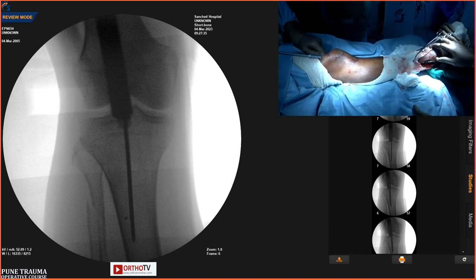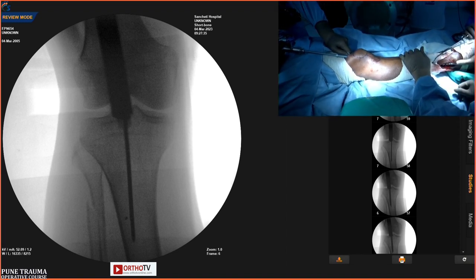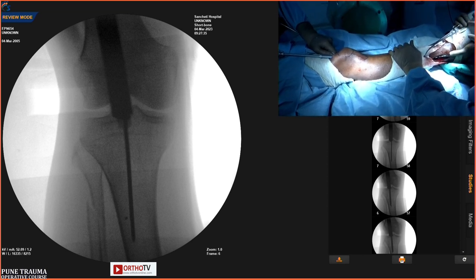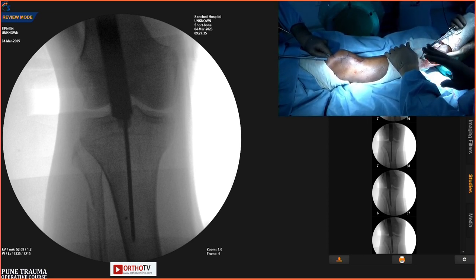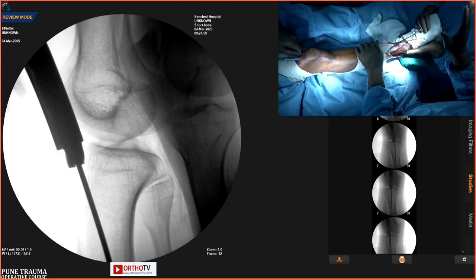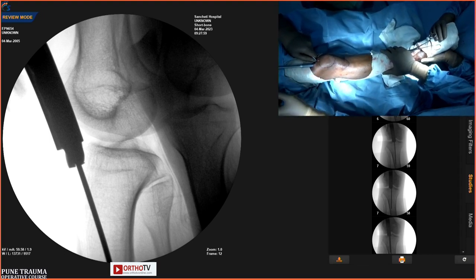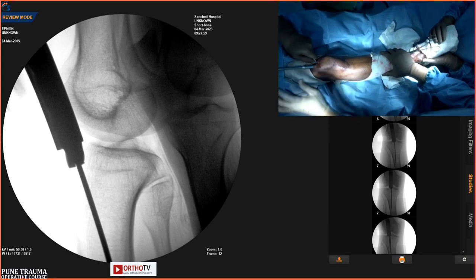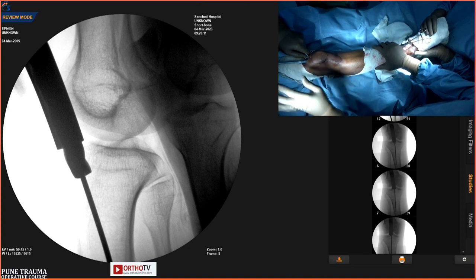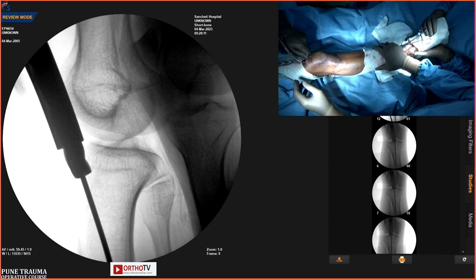Delegates, if they want to ask any questions, they are free to ask. We'll convey to the hall. There is no damage to the cartilage of the patella. Now we can see it is a perfect placement in the upper quarter of the tibia. So what will happen now? Now we'll exchange the guide wire. Then you can tell.